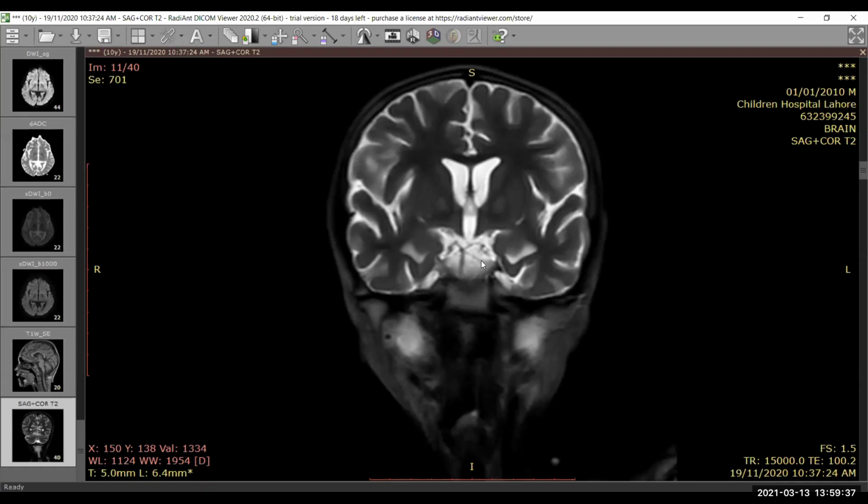Just if I can ask, what should be our approach to pediatric X-rays with increased bone density? How should we proceed? Yes, common things first. First is osteopetrosis. Pycnodysostosis, I have seen a number of cases. We do see them on and off, but that should be mentioned in a differential. Other is myelosclerosis, which can sometimes give increased bone density, but we don't see them so often.